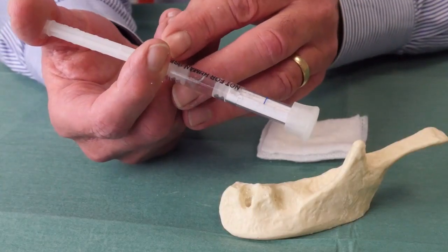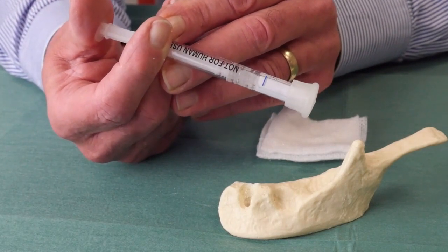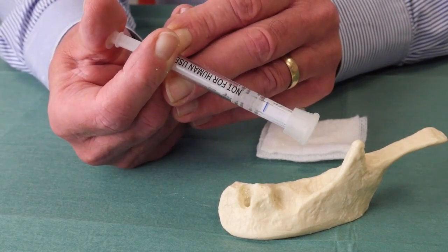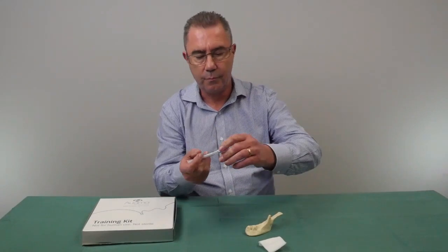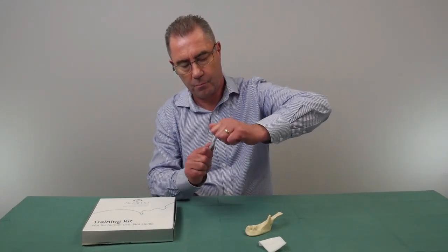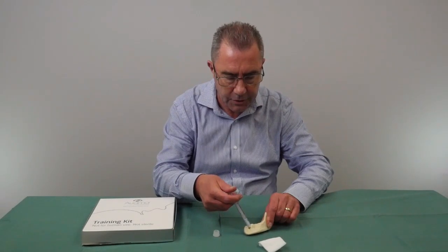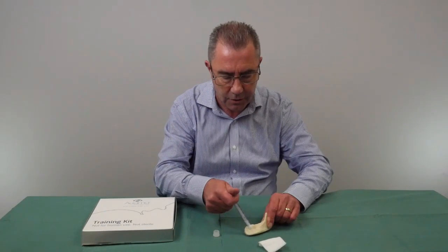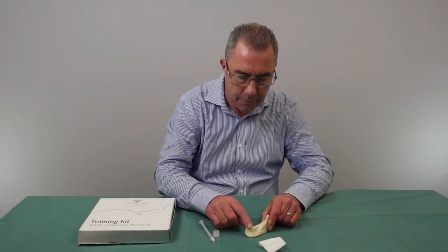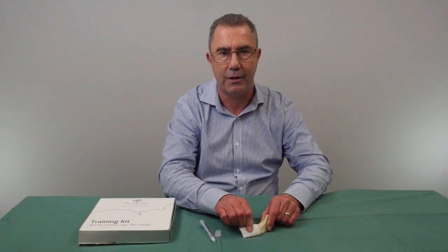Let me now show you in reality how this works. Compress the plunger so that the liquid mixes in with the powder — it takes some time to completely mix. Once completely mixed, take the cap off and dispense the Bond Apatite into the socket. This is the same sort of technique as with MP3, where you can dispense the material straight into the socket. Then shape the material as required, take a dry gauze, press it on, and that completes the setting process.